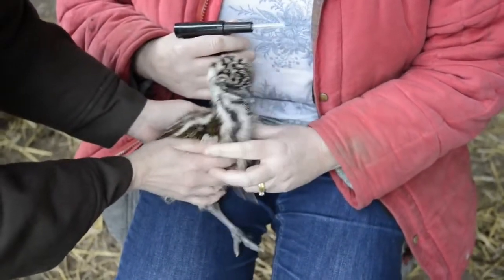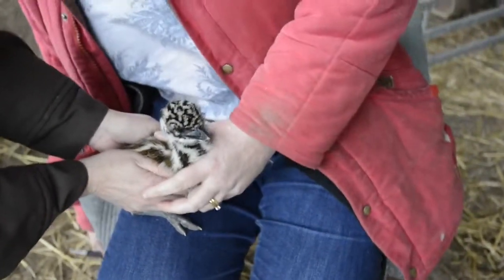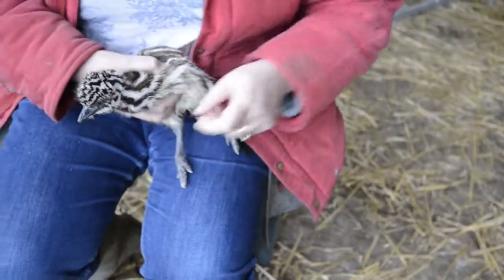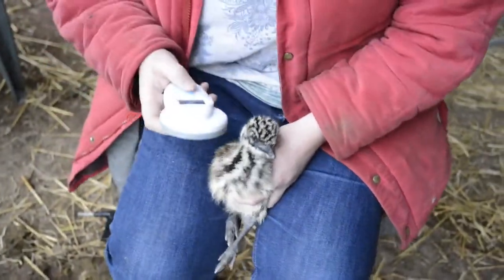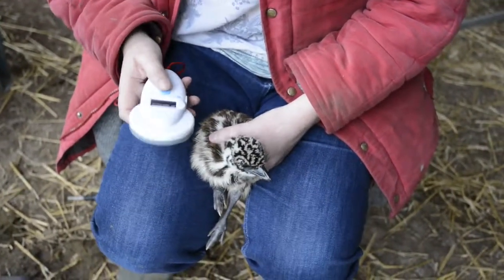One happy chick with a microchip inserted. We can put him or her down on the floor and let him go and find Dad — but let's just check the chip is in place first. And that proves the chip is actually working after being inserted. That's wonderful.